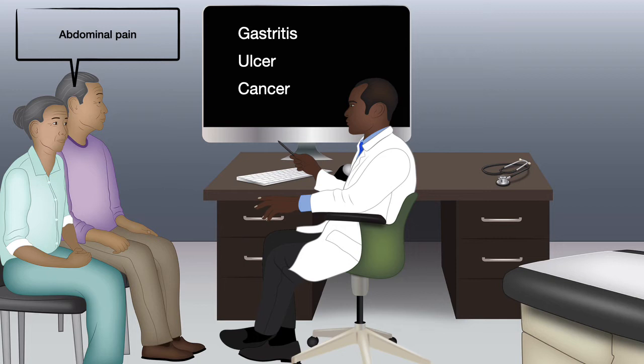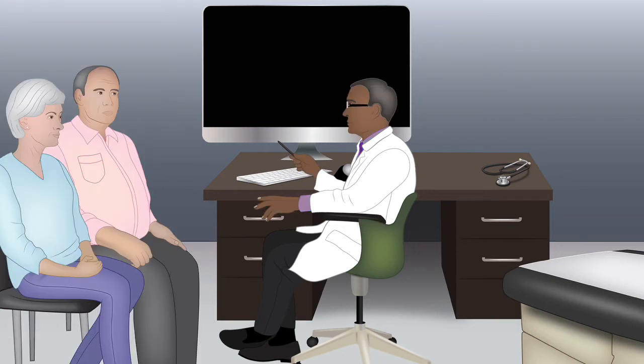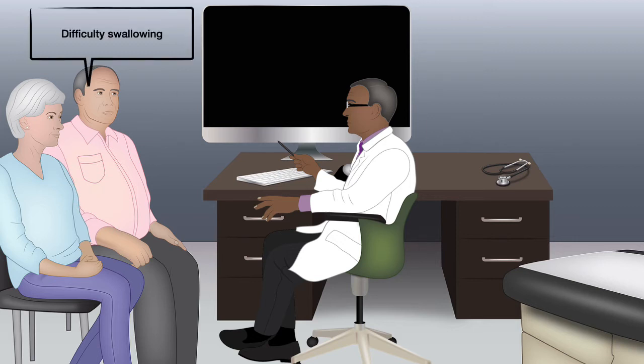So now let us look at another patient who comes in and says that he has been having difficulty swallowing.